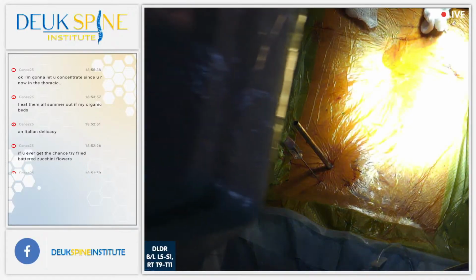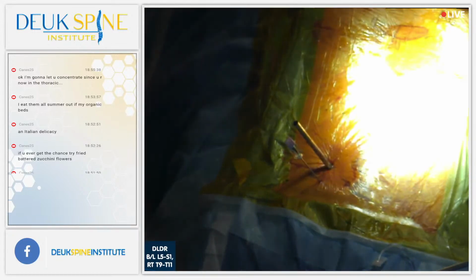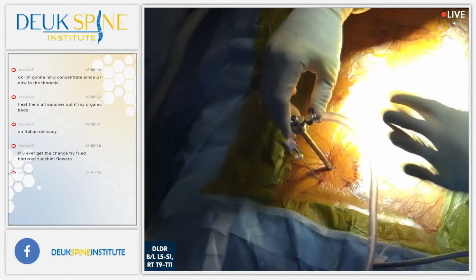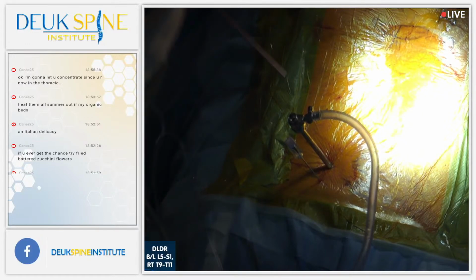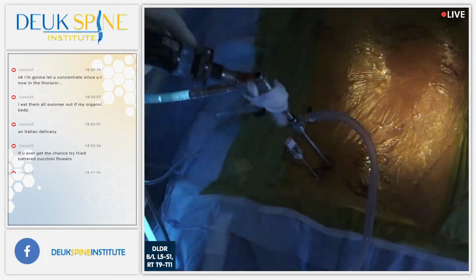All right. You guys can see what we've done here. We've done this for so many years. We feel really confident. There's a tube sticking out of this person's back like a porcupine. But that tube goes straight into the disc that's herniated and torn, that's causing all this patient's pain. It's a thoracic disc. This is number 10-11. Next, we're going to do 9-10. That will be our last one.